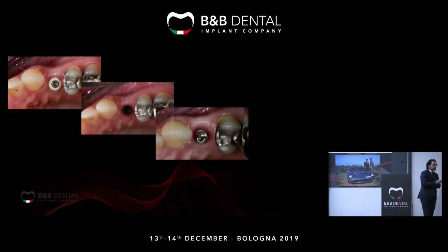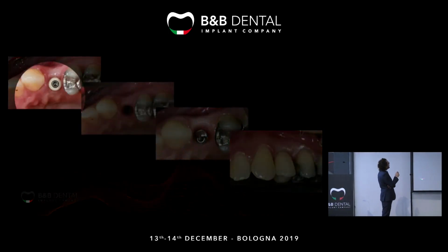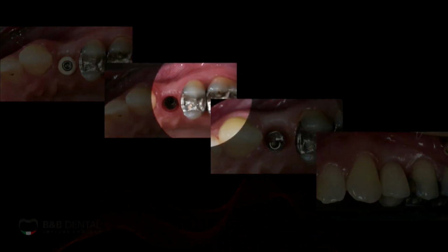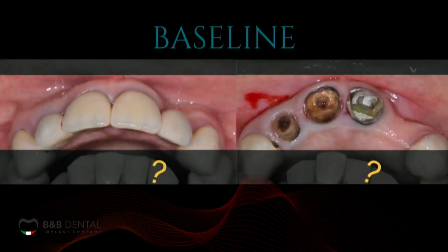So after a few appointments, we deal with this kind of healing after 3 months, and then we can use this soft tissue to shape it with a provisional and go ahead with the final crown. So even in type 3, type 4 bone, we can insert an implant with one stage surgery and finalize the case in a very minimally invasive way.